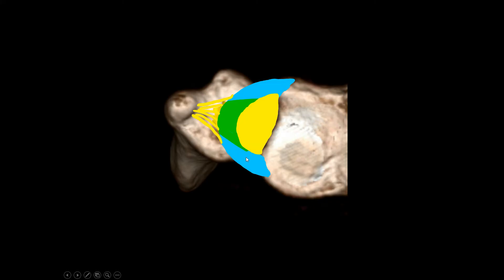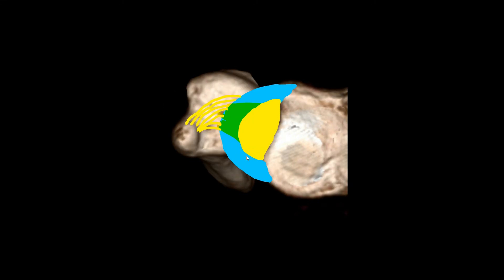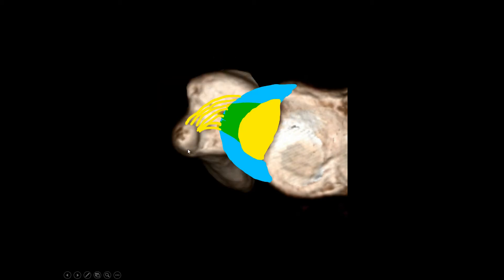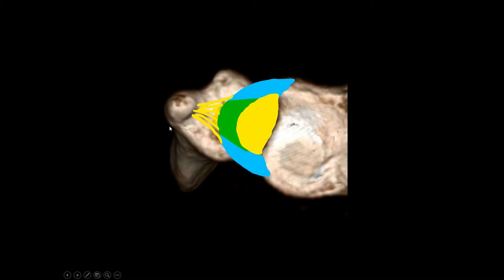If you pronate or supinate your wrist, the position of the disc itself stays more or less the same, but what moves are these insertions. If you scan your patient with the wrist in supination, on your coronal views you get partial volume effects for both laminas, especially the one to the ulnar styloid — so make sure you don't misinterpret this as a tear. You can easily tell whether the exam is pronated or supinated by the position of the ulnar tip: showing dorsally means supination, volarly means pronation, and laterally means neutral. You want to scan in neutral position to avoid partial volume artifacts.